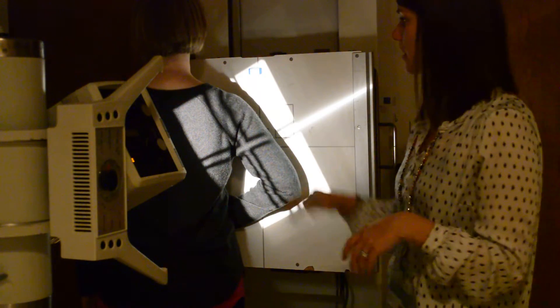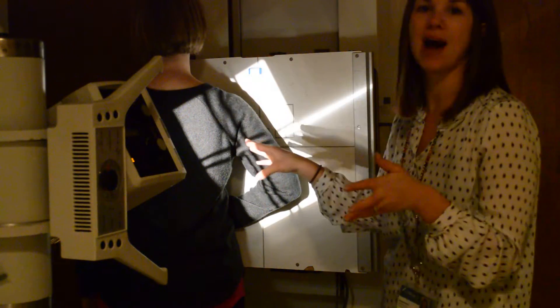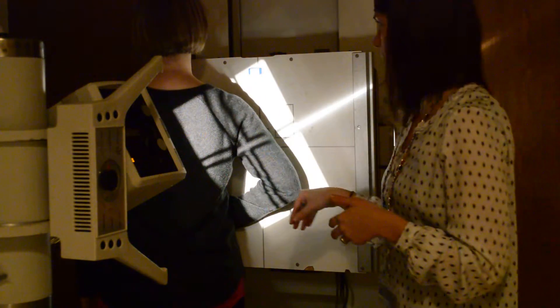So that is your AP and your lateral. For the lateral, you can choose to do it as AP or PA. Both require you to oblique your patient in order to reduce that OID.